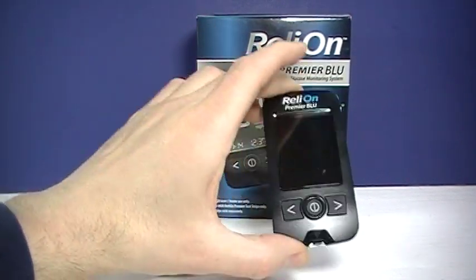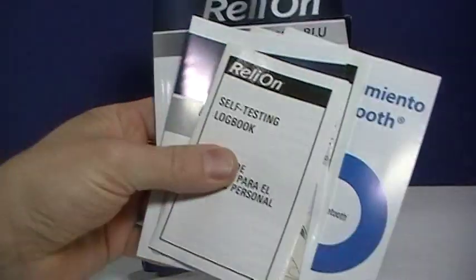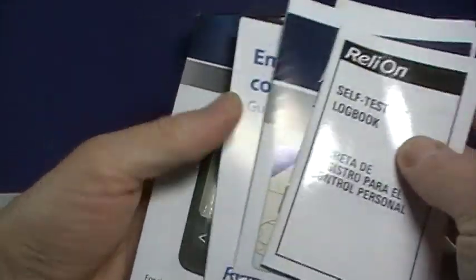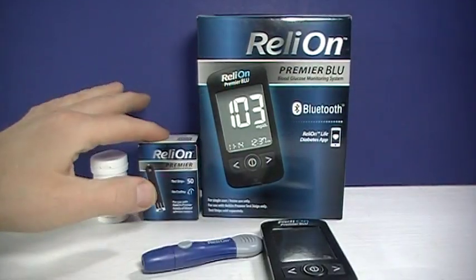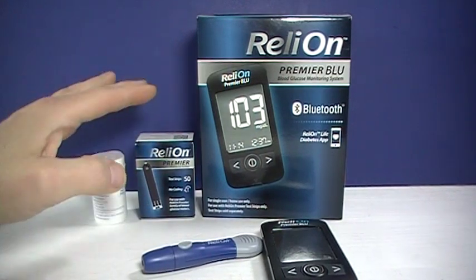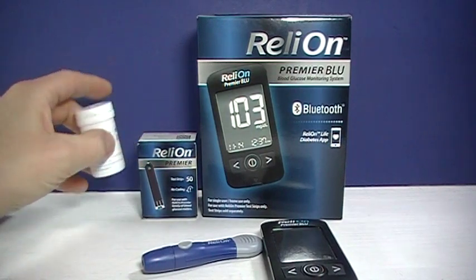Included in the box, you get the meter, you get a carrying case, and you get a quick start guide, log book, as well as the user manual. It does not come with the test strips — you'll have to buy those separately. Those run about $0.18 a piece. They come in 25, 50, or 100 count. That's what they look like in the box there.